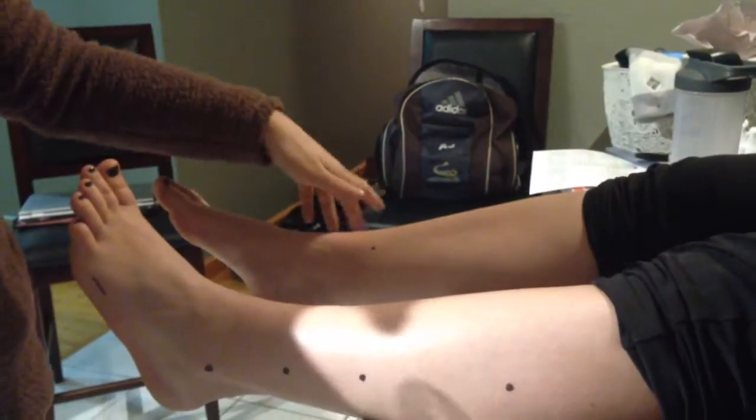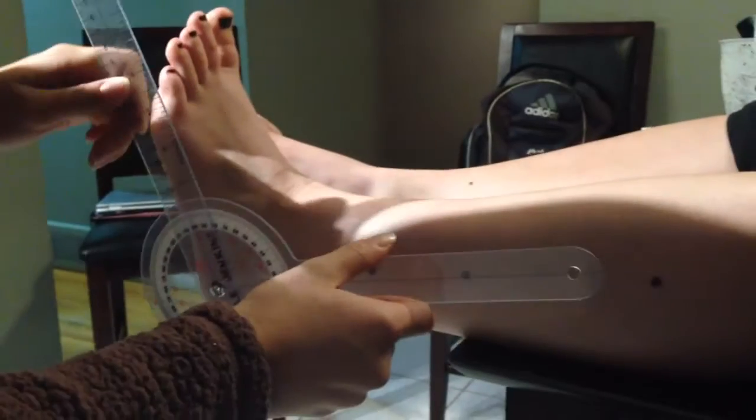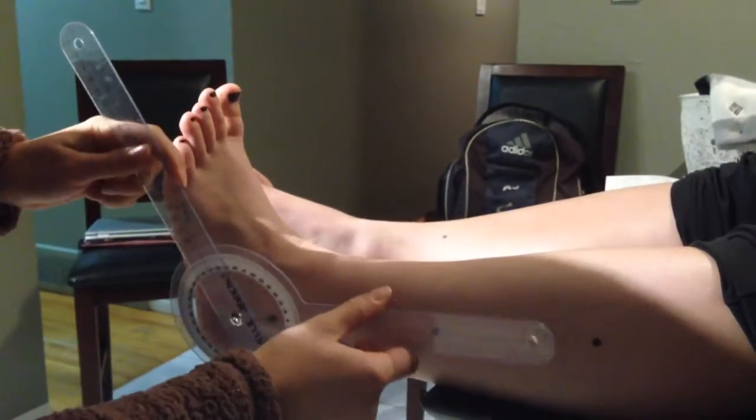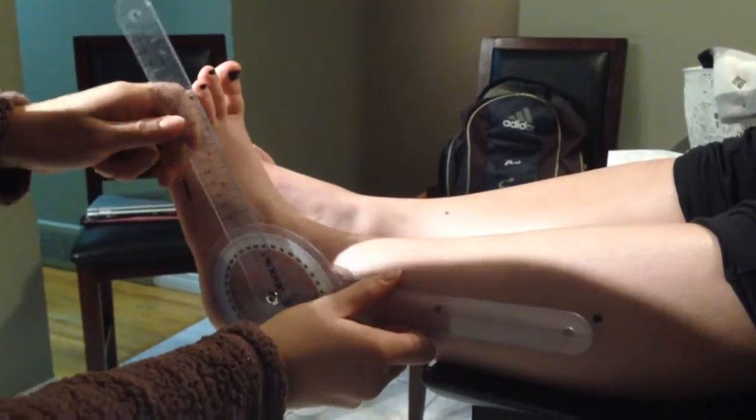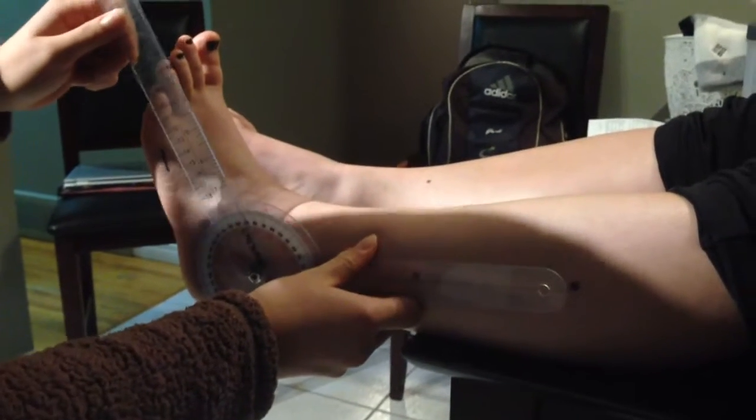Hi Janelle, I'm going to be measuring ranges of motion of the ankle. This is a second day old second degree eversion sprain. This is the uninjured side and this is the injured side. Okay, I'm going to line up my goniometer with the stationary arm along the head of the fibula, the fulcrum on the lateral malleolus, and the moving arm parallel to the base of the fifth.